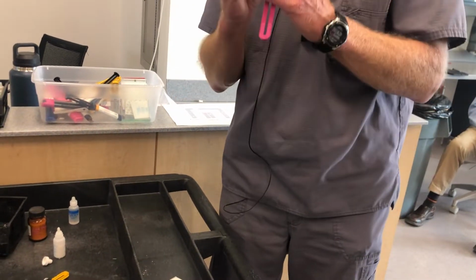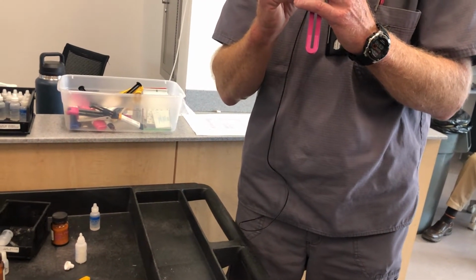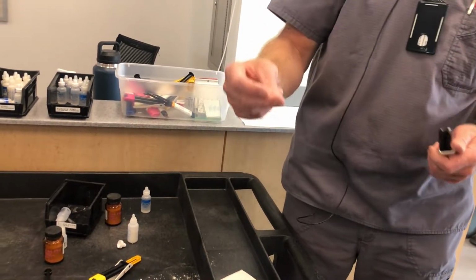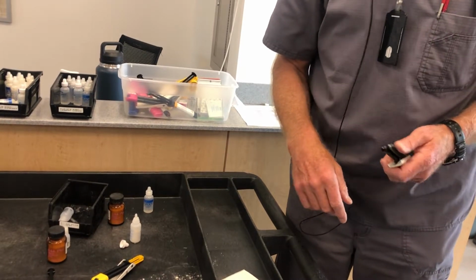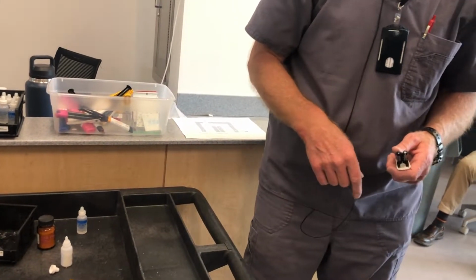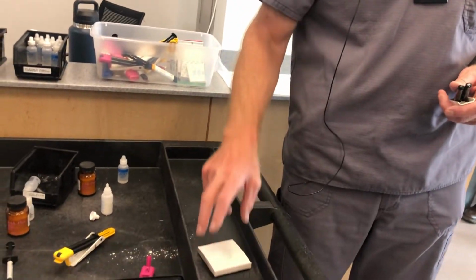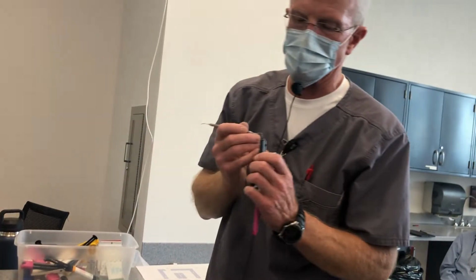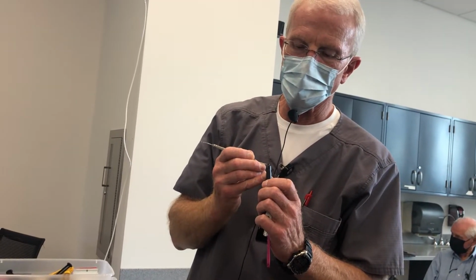Does somebody have either the end of a perio probe or something like that, or an Explorer will work, anything along those lines. If you ever use something like that to unplug one of these, you want to be really careful not to leave any cement residue on your instrument. Got it, Taylor. Oh, thank you very much. Yep, that should work. It's just getting a little gummy, a little old.